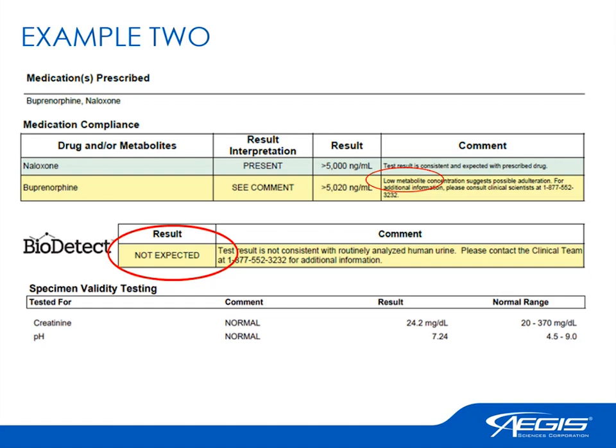These findings, though, do suggest post-collection addition of the buprenorphine and naloxone product to the specimen in an effort to appear adherent. The one thing I do want to emphasize with the metabolite: the metabolite that we detected here was a very small amount of norbuprenorphine, and it is thought that the heat that the individual uses on these products to warm either the synthetic urine or whatever substance they brought in, the metabolite is just a degradant.